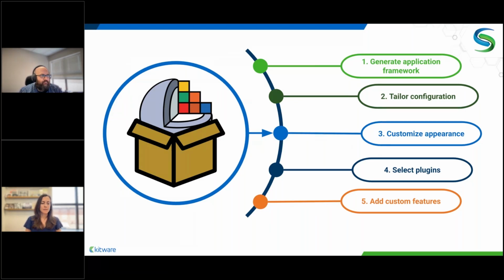the broad capabilities of Slicer are a strength for some, but also a steep learning curve for other research groups that have very focused goals. So another important pillar of SlicerSALT is the Slicer custom app template, which is just a customization wrapper around 3D Slicer that we use to create a very custom, lightweight version of Slicer concentrated only on shape analysis.